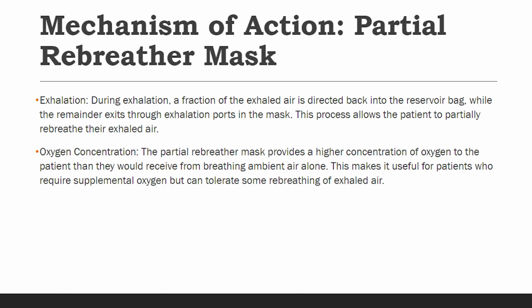This feature is particularly beneficial for patients who require supplemental oxygen but can tolerate some rebreathing of exhaled air. Understanding this mechanism of action helps us to appreciate how the partial rebreather mask effectively delivers oxygen while balancing rebreathing to specific patient needs.